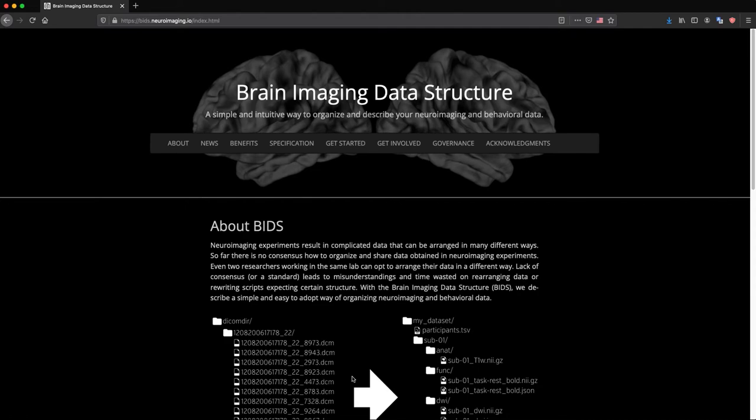So to begin with, maybe we can spend a minute talking about BIDS. BIDS, or the brain imaging data structure, is a data structure format for neuroimaging and behavioral data, which is simplified and intuitive to both users as well as developers of scientific software tools, specifically in the neuroimaging domain. While there is no specific proposal for DBS data from BIDS, we have attempted to develop a middle ground which we hope will work well for both users and developers.